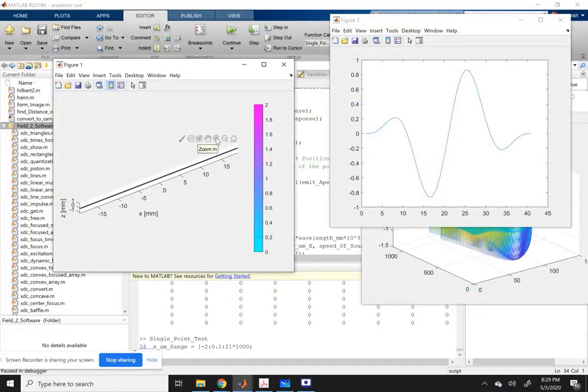This is your transducer array, which was defined by us. Each of these elements has a certain width and height, and there are a total of 128 such elements. This defines your transmit and receive aperture, and it is displayed here.